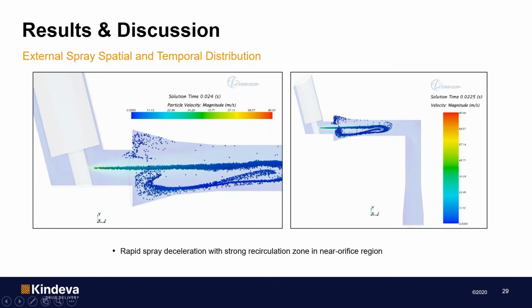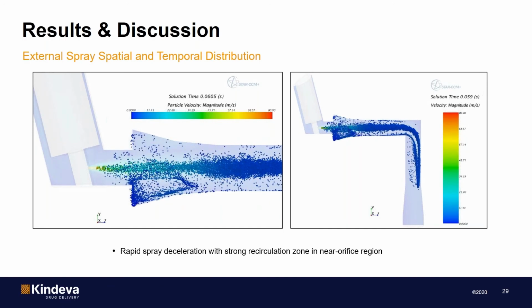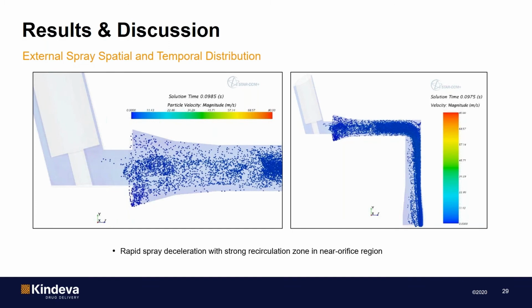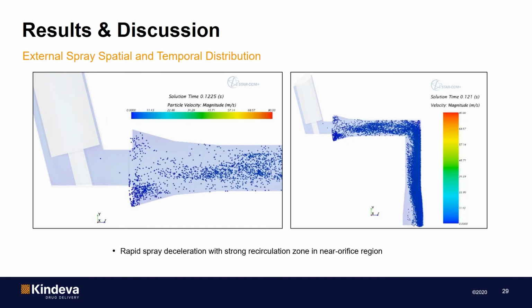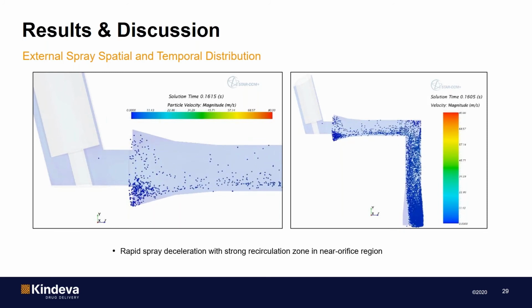So you can see that the spray is basically emitted with a very high velocity, something in the order of 80 meters per second, but then rapidly decelerates to values of around 30. You can also see the existence of a very strong recirculation zone, and also the spray is skewed towards the outer wall of the vertical pipe of the induction port as well.